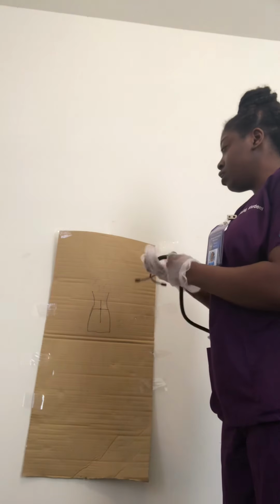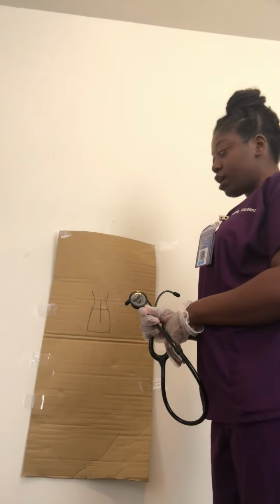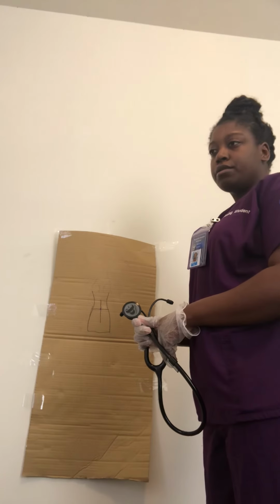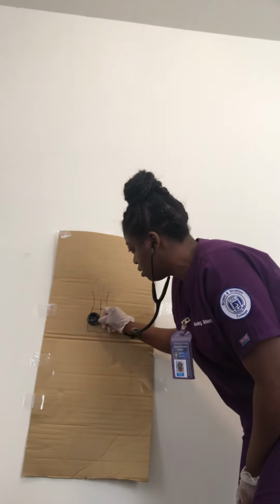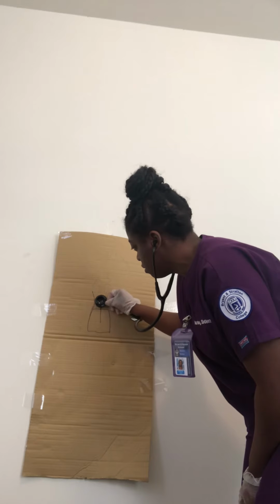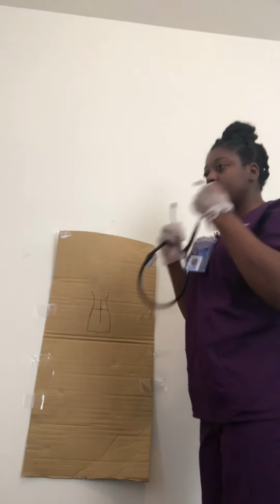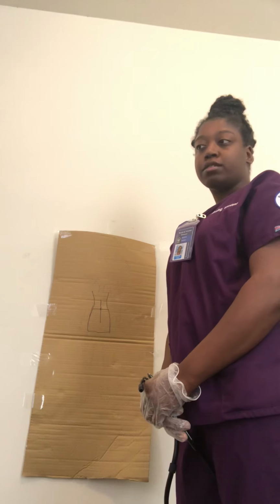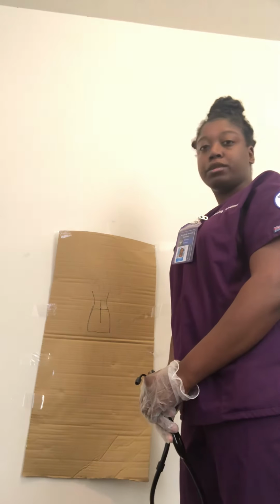Now I will auscultate using the diaphragm of my stethoscope for bowel sounds. I will start at the right quadrant, which is the most active because of the ileocecal valve. This is the diaphragm of the stethoscope, and I'm starting at the right quadrant. Bowel sounds are active. Bowel sounds could either be hyperactive, which is fast moving, hypoactive, which is slow moving, or absent. If there is an absence, I will listen to each quadrant for 5 minutes and a total of 20 minutes.